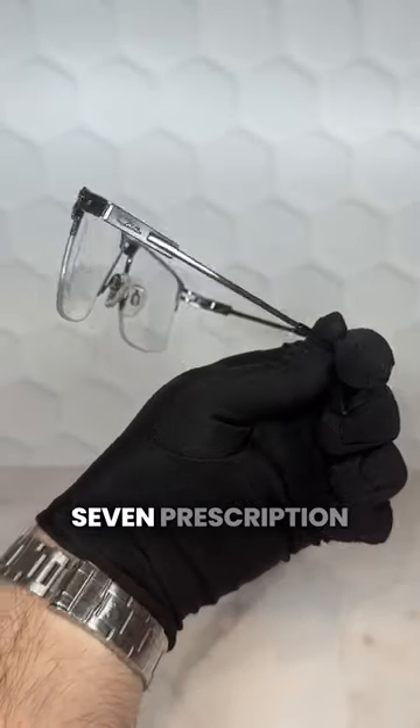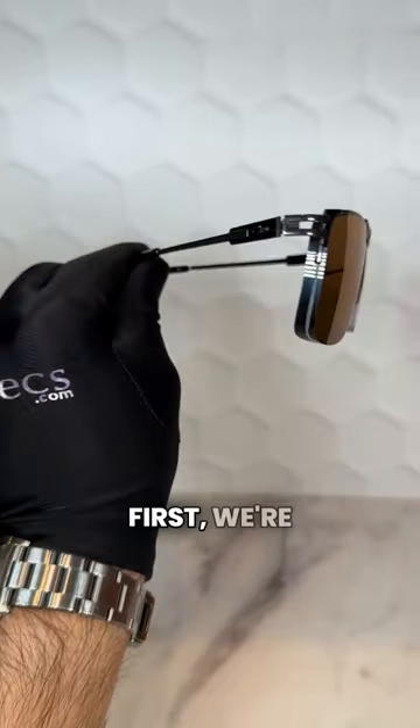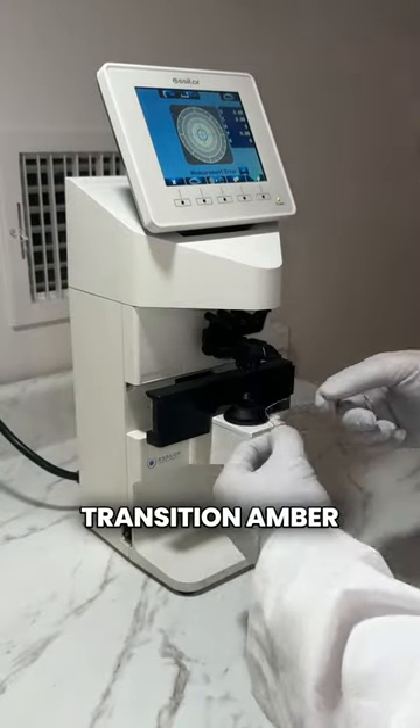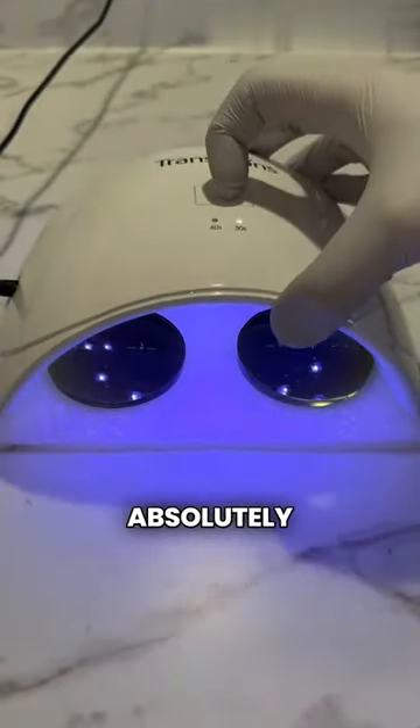These Cazale glasses have a minus seven prescription and today you're going to watch how they were made in the iSpecs lab. First, we're going to dot the center of the demo lens so the machine can scan the shape. The customer chose transition amber lenses, which are kind of a lighter brown shade, but they look absolutely gorgeous.